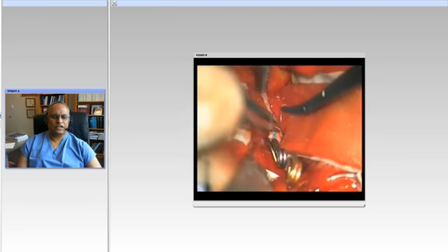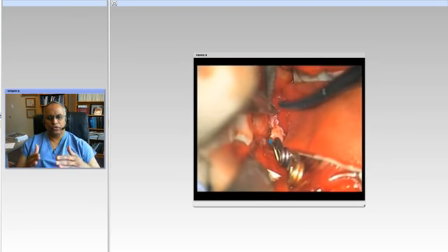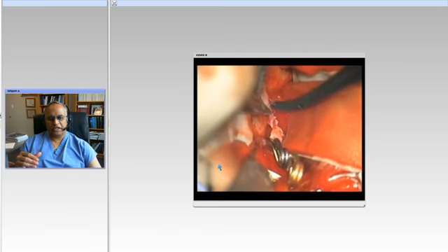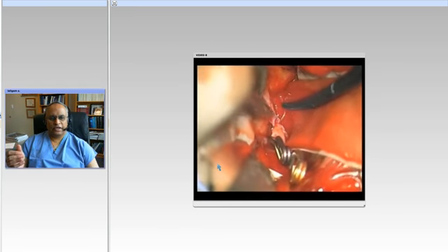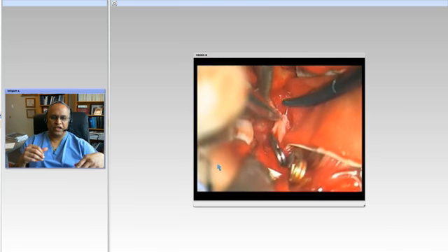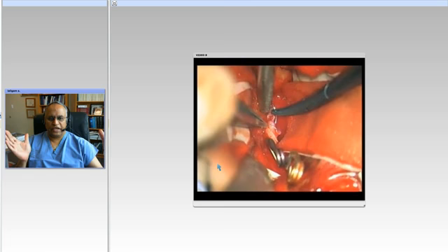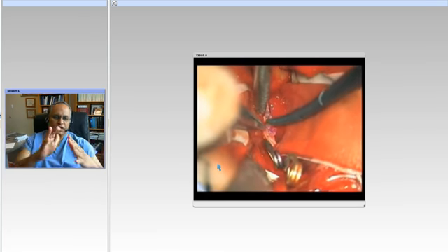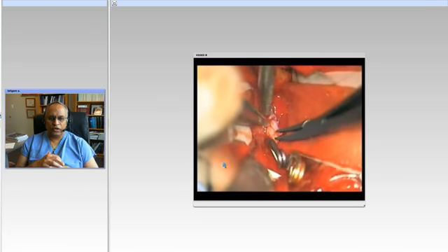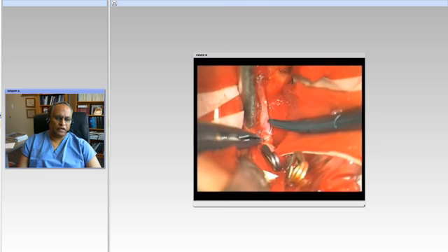Now we're working on the distal segment. Here I put it right at a bifurcation point. So keep in mind, remember that there's a M2, M1, M2 bifurcation segment. So I'm putting it right into that bifurcation. So I fish mouth the graft such that I have a little bit wider opening to come into. And we use the same technique of suturing.